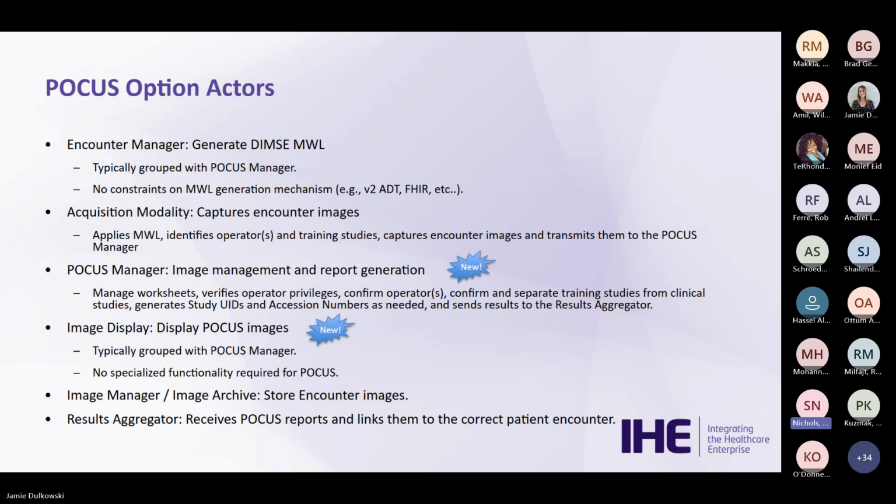Thank you. So in EBIW, the existing actors fulfill their same roles. We have the encounter manager, acquisition modality, image manager, image archive, and results aggregator. Those in point-of-care ultrasound fulfill their same roles. What we did in the POCUS option was introduce, as Rob had mentioned, the POCUS manager. Now, in real-world implementations, we see that the POCUS manager is typically grouped with the encounter manager and image display, but the POCUS manager has a pretty large role in this workflow.